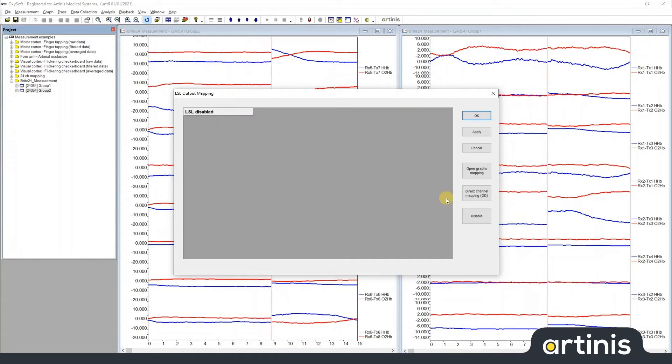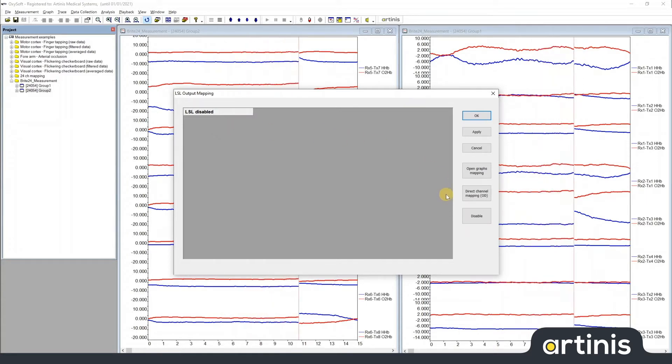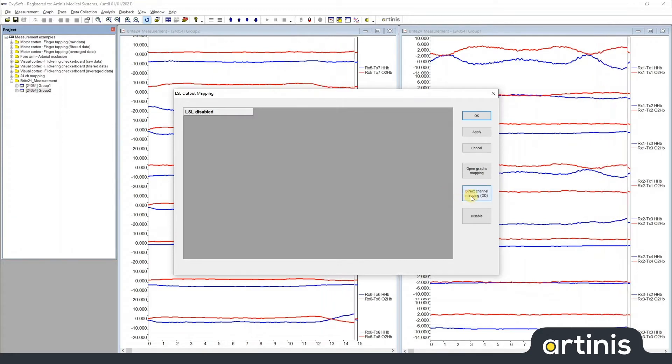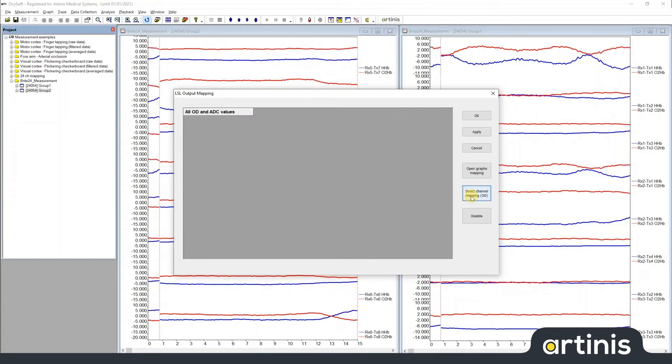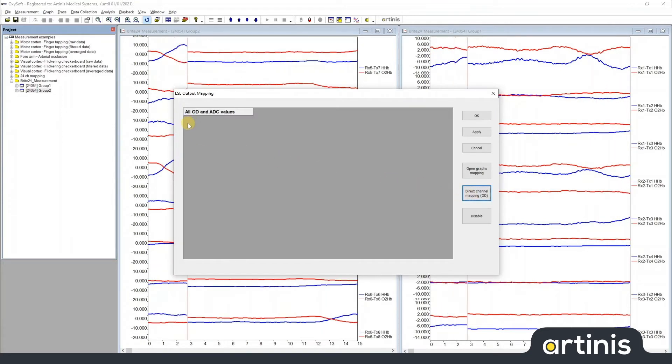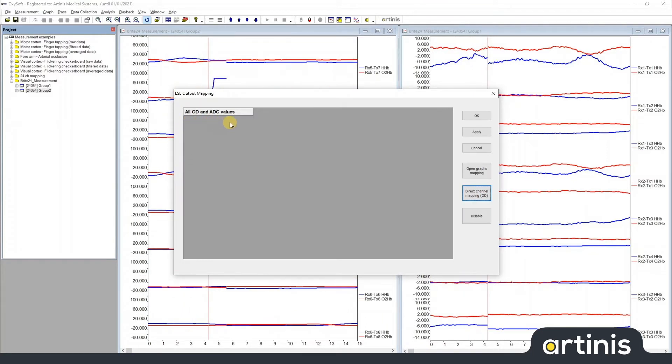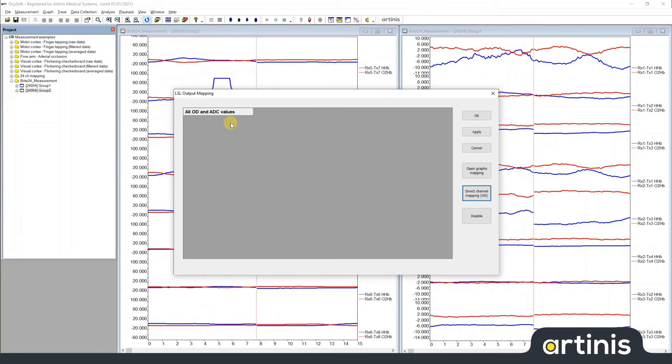There are two different modes of streaming data out from Oxysoft via LSL. The first is so-called direct channel mapping. As you can see, this streams all optical densities and any other signals you have present in your measurement.